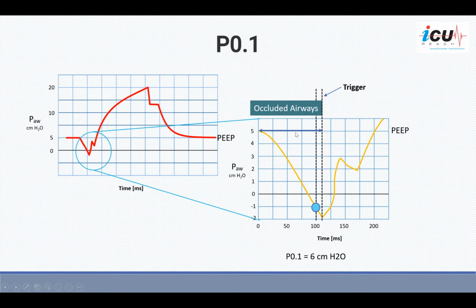And the pressure decrease here represents the inspiratory or the respiratory drive. The muscles did not see yet any effect of airway resistance or lung and chest wall elastance. So the drop in the pressure here in the first 100 milliseconds would be an indication of what's happening in the respiratory drive. Of course, you need to have good muscles also to be able to generate that drop in the pressure.